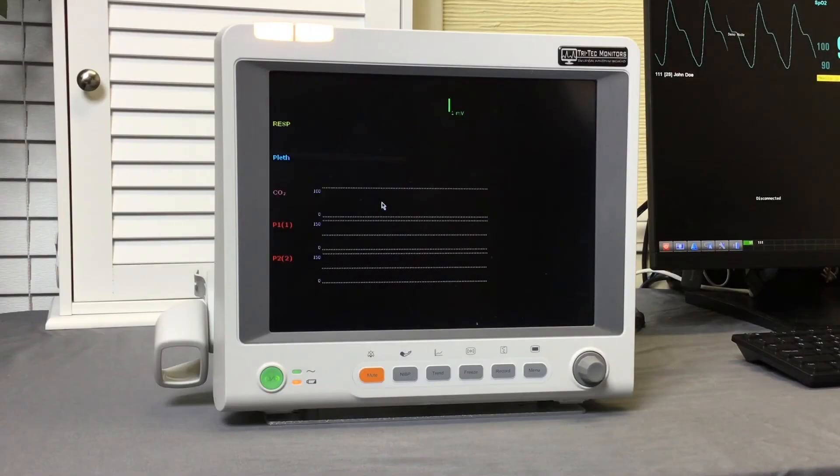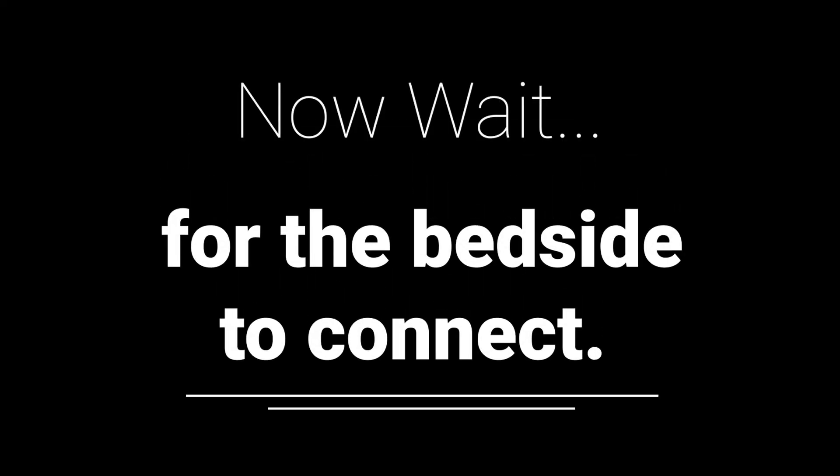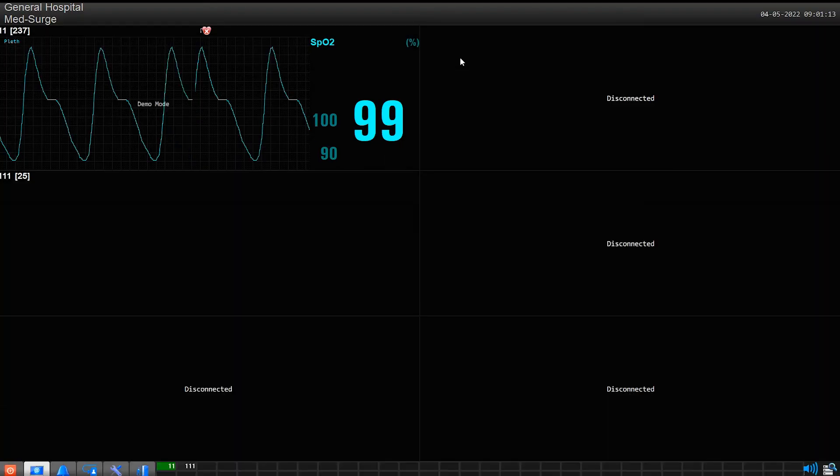Step 2. Watch the display screen to make sure the bedside turns on. Now wait for about 2 minutes to give the wireless bedside's transmitter time to connect to the central station.